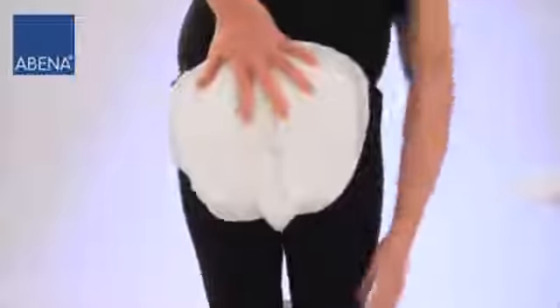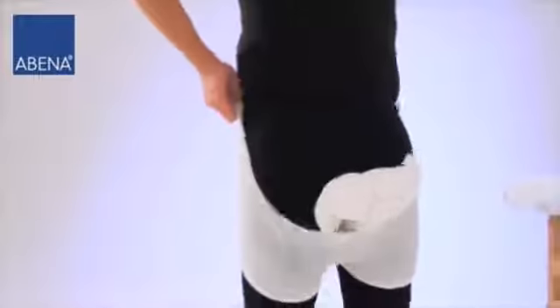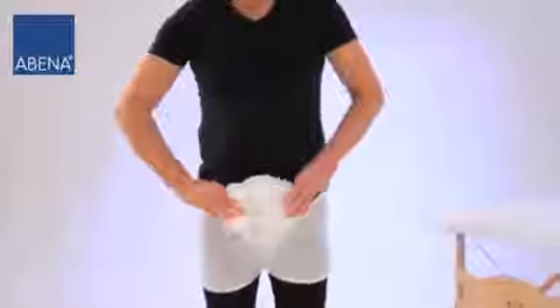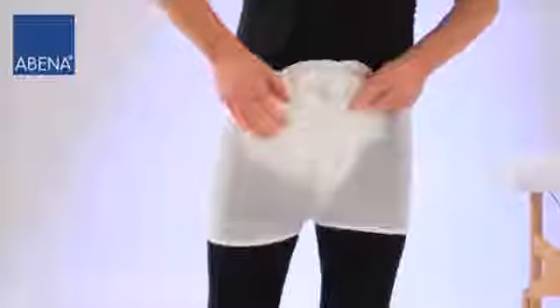Then pull up the fixation pants at the back first and stretch the front side widthways as well. Now also pull the front of the fixation pants over the pad. Make sure that the fixation pant covers the pad completely and correct it where necessary.